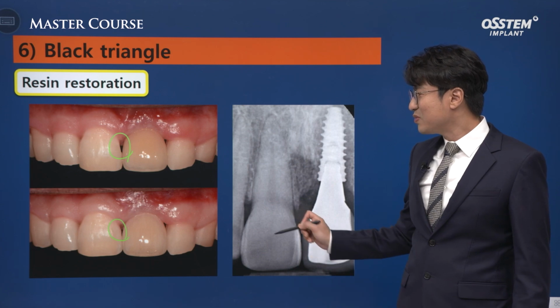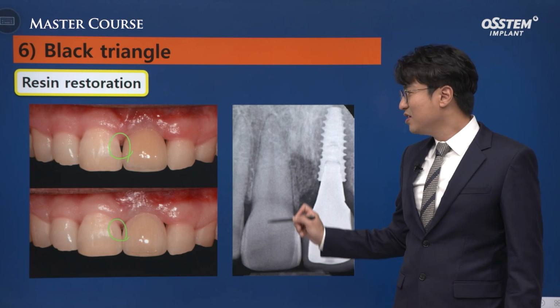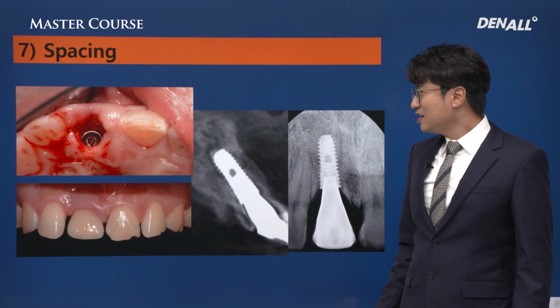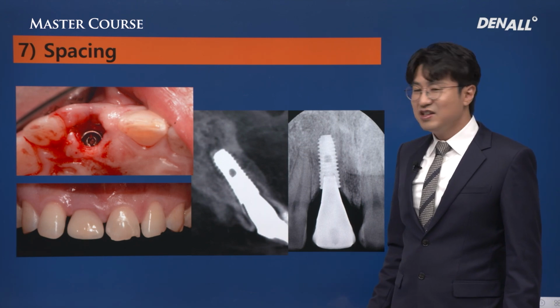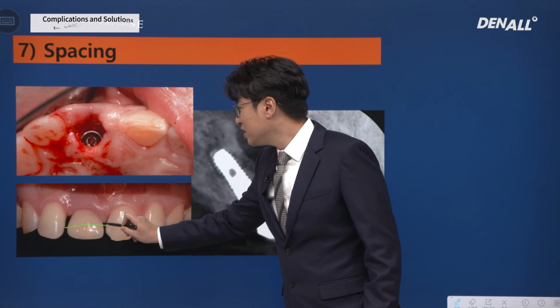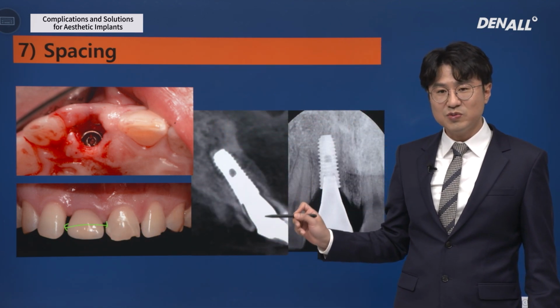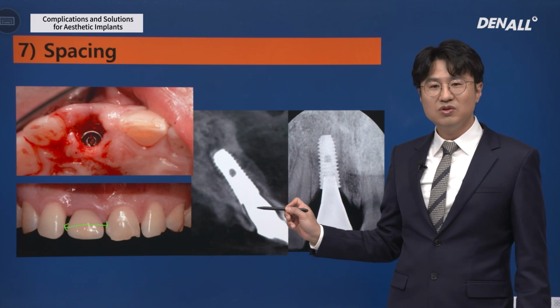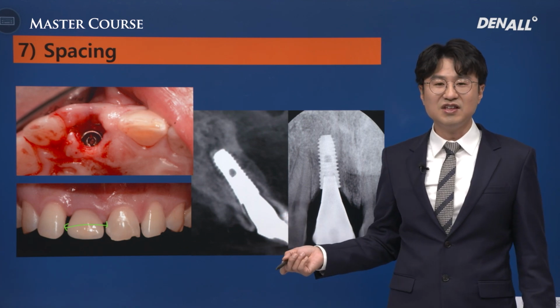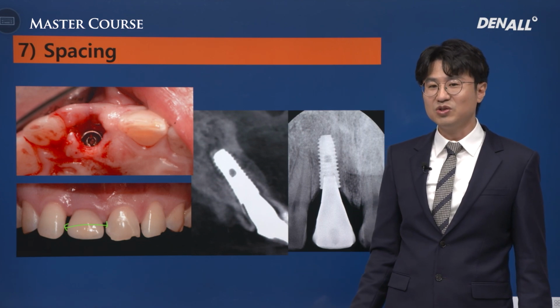This case leaves something to be desired because there's a big difference in the colors, and the porcelain itself is too much glazed. So this is the case from the previous lecture. The restoration space is too wide compared to the adjacent teeth. It is a congenital situation. Give the choice to the patient. If the adjacent tooth is not to be restored with a resin crown, leaving the space like that would not be a bad choice. The patient is used to it from before the tooth loss.